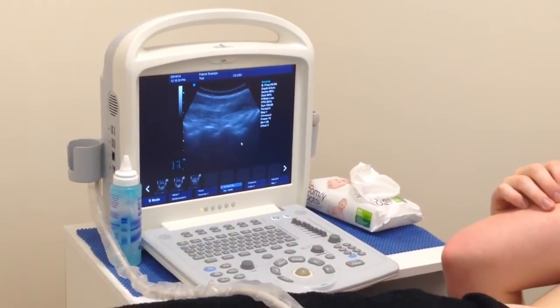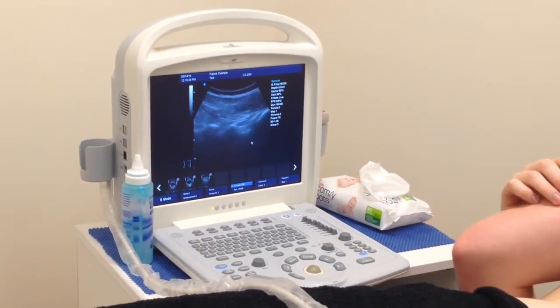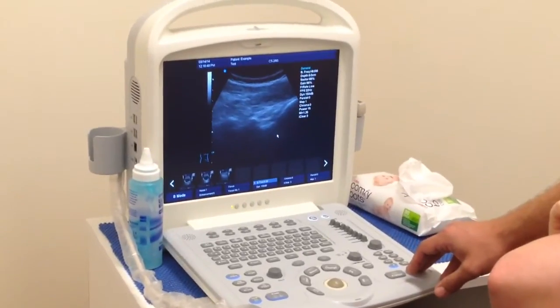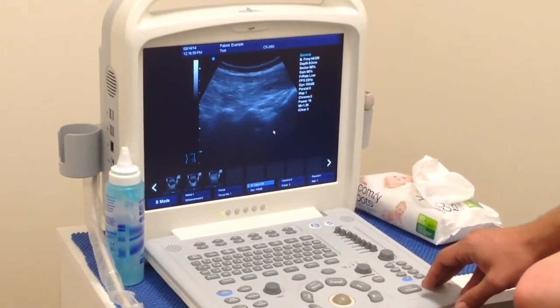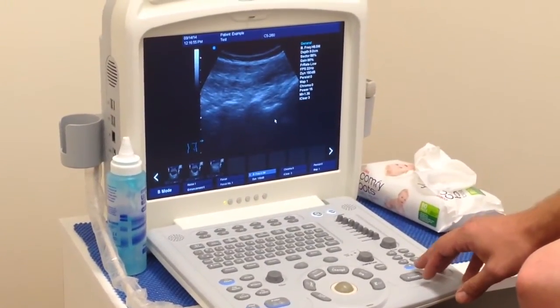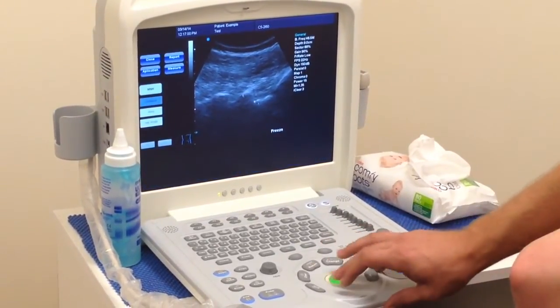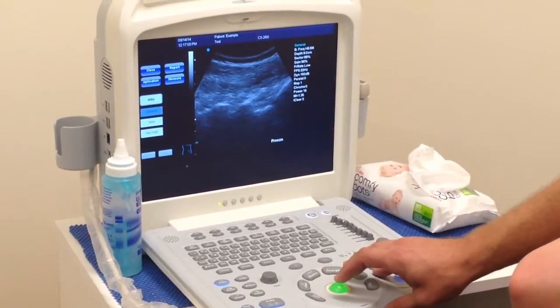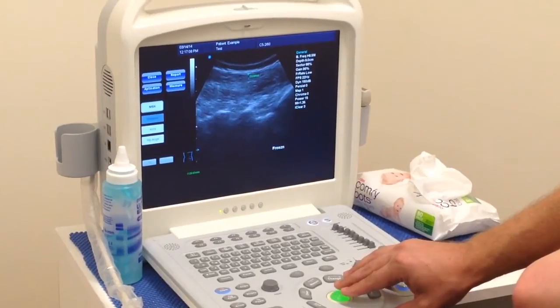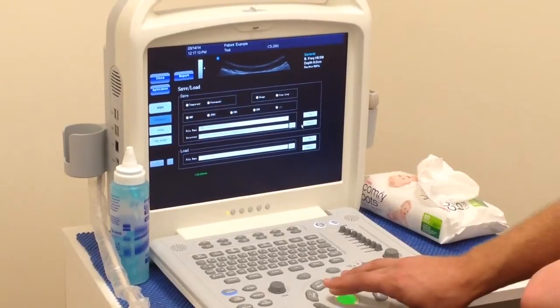Now again, if we want to save an image of this, we're going to put that L4-5 right in the middle of the screen, because that's the area that we're looking at for the moment. We're going to make sure that we're not putting too much pressure on the probe, because that's going to compress the muscle and give us an incorrect reading. So we'll just really back off the pressure there, get a nice image, and we're going to freeze that. And then we're going to measure it, and we'll save it. So we pick distance. Set that there, then I'm going to save that image, save it as a JPEG again.